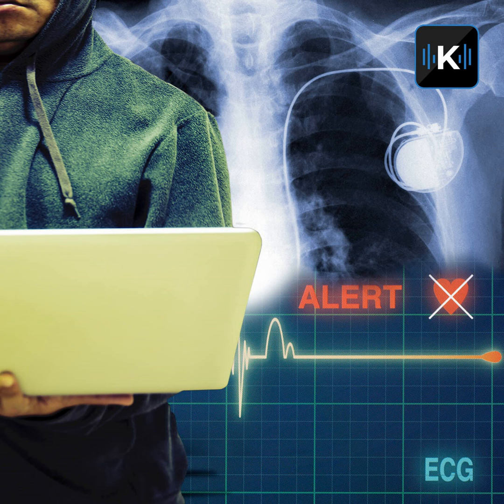Just this year, vulnerabilities were found in Abbott Labs' implantable pacemakers. They discovered, just like Barnaby Jack did years ago, that a hacker could issue commands to the pacemaker, causing it to drain its own battery and then give unnecessary painful shocks to the patient.